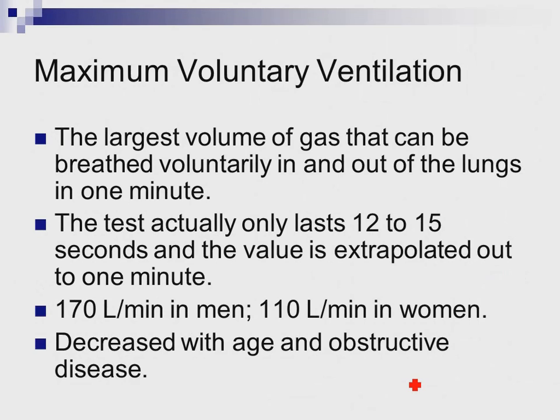All right, a couple other tests just to mention. One is what is called the maximum voluntary ventilation, or MVV. It's a test that only lasts 12 to 15 seconds because, as I describe it, you'll know why. You basically want the patient to take as deep and as fast a breath as they can.